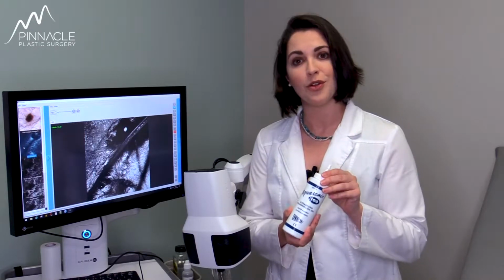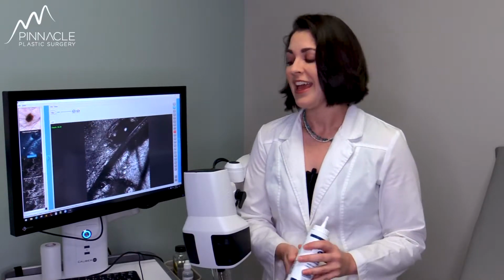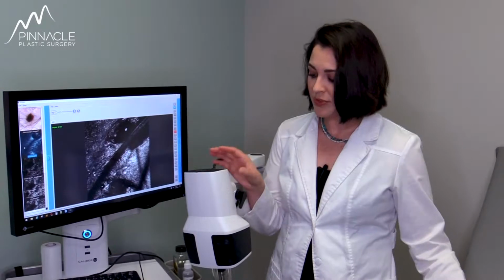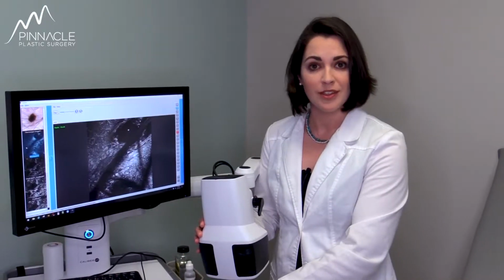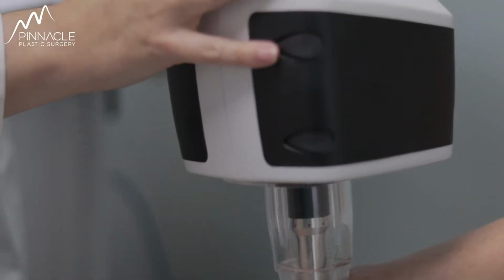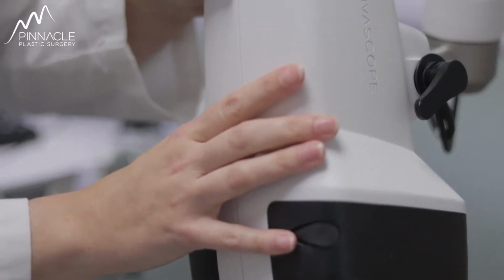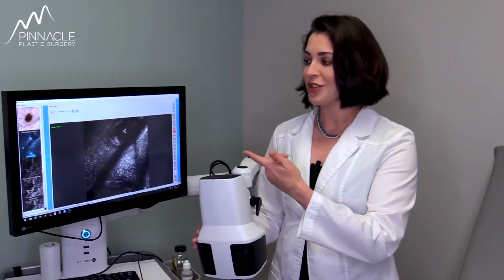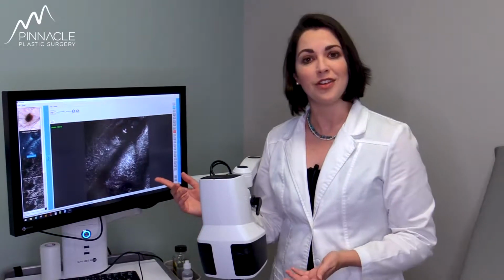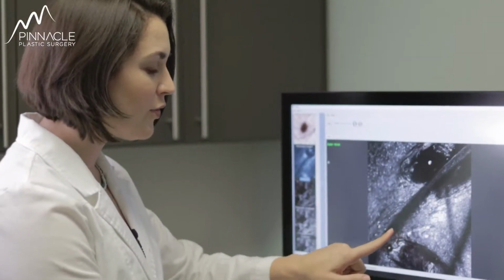We put a little bit of this ultrasound gel on your skin, and then this arm moves, so it will move around, and we place it directly on your spot that's concerning. And it really just sort of sits there and touches you. There's no heat, there's no pain, there's no numbing medicine. And while you're sitting there, you actually also get to watch your skin lesion on the screen. So we're going to image it in different layers.